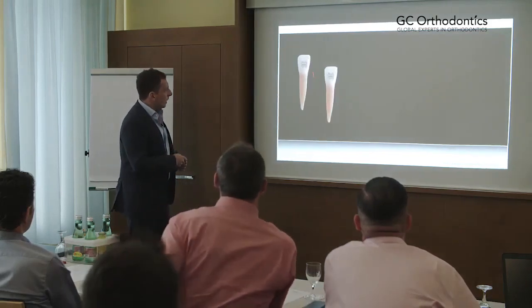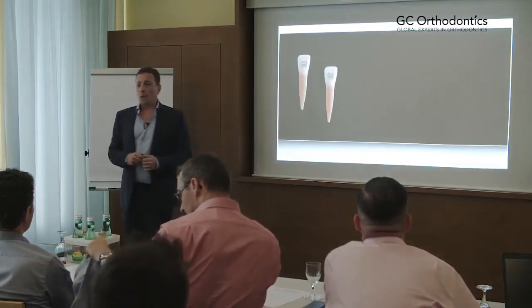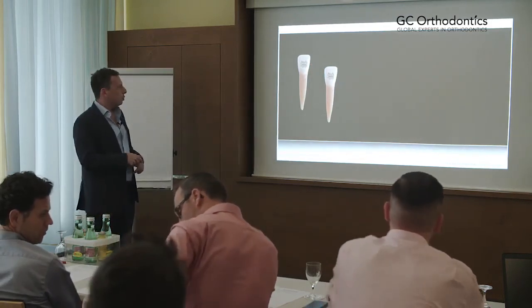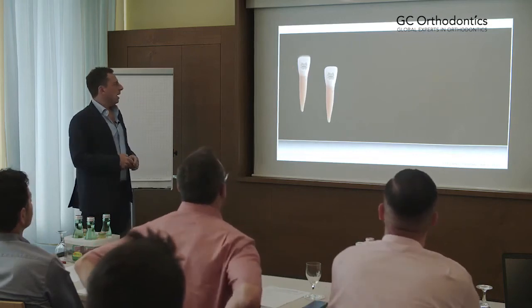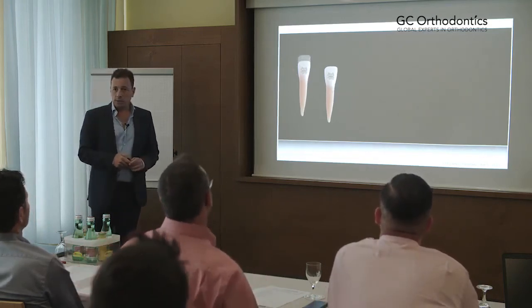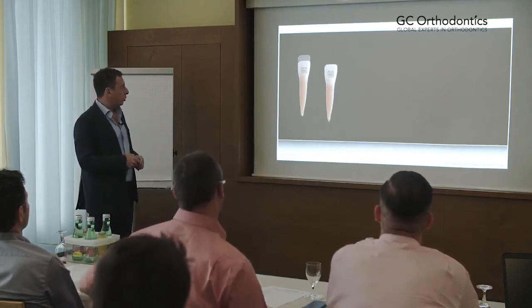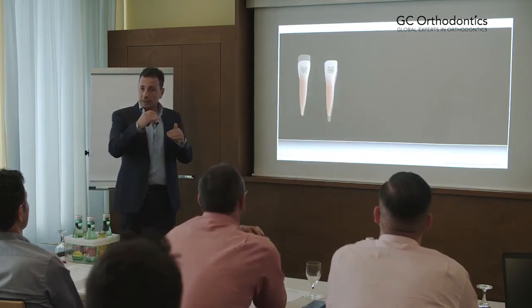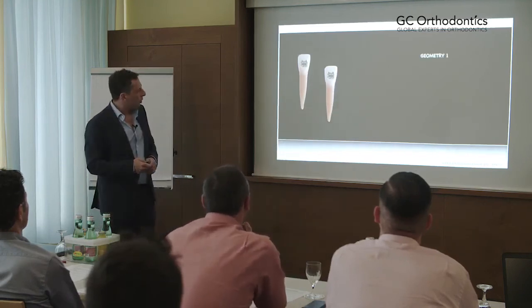It says that when you are in this situation, and when you've got a vertical malalignment of 2 teeth, and you want to achieve this, you would like to intrude the tooth that is more extruded, and you would like to extrude the tooth that is more intruded. You would like to level them. And how do you think you achieve this?